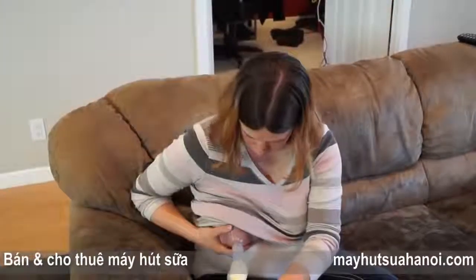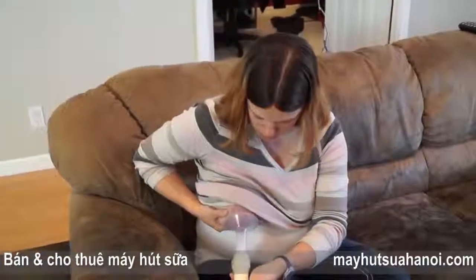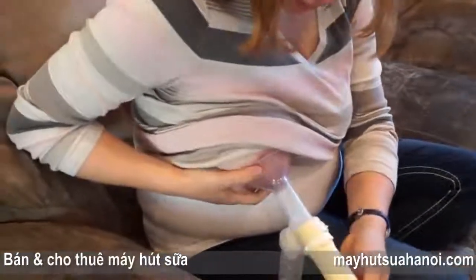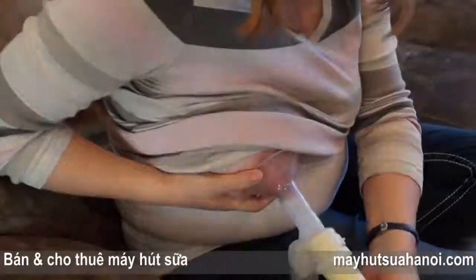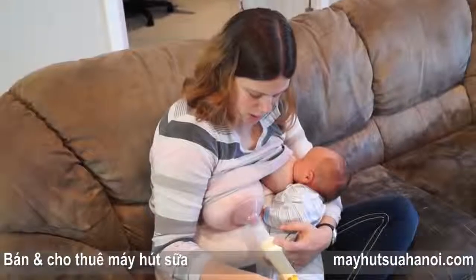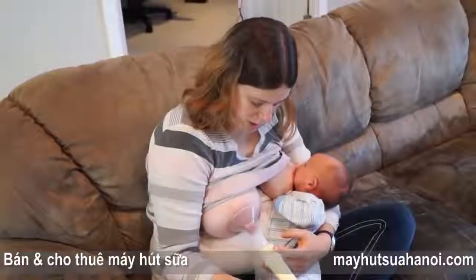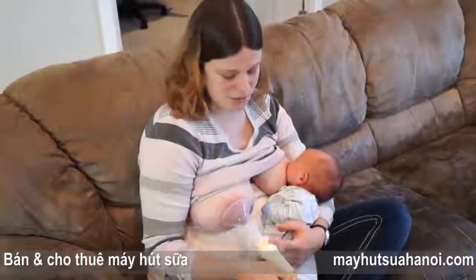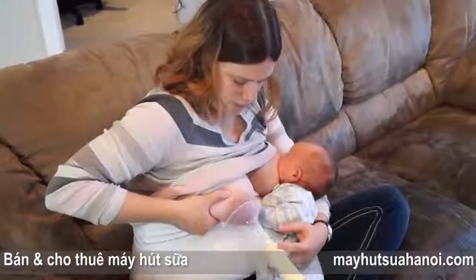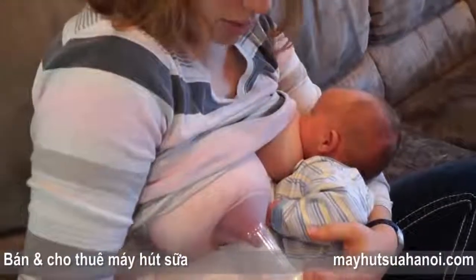If your milk flow starts to slow down, massage or jiggle again, and maybe reposition the pump slightly, and then keep going, and you might find that you can get some more out from some different ducts. One thing that can help some women who have trouble producing for the pump is to pump one side while the baby nurses on the other side, which does take a little bit of coordination. But this way, your baby will trigger letdown, and you'll get the double stimulation of the baby nursing on one side and you pumping on the other.